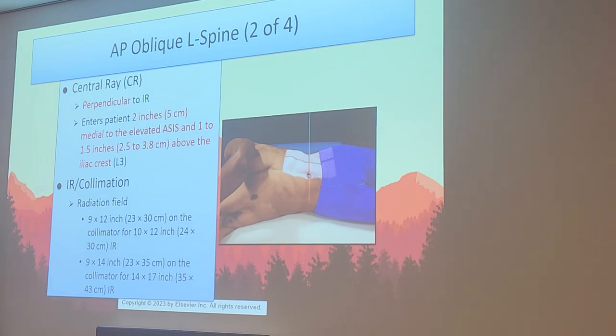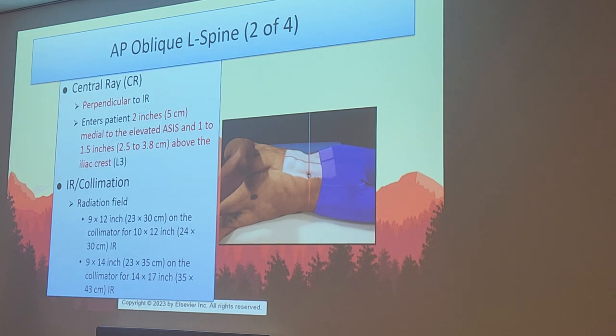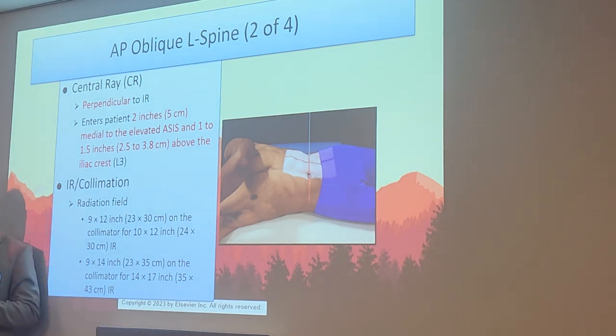All right, we are still using a perpendicular central ray. Now, the centering, please make note of this centering. It tends to throw a lot of people off. We are going to be 2 inches medial to the elevated ASIS. In other words, we are centering towards the elevated side or the upside. And we're going to be 1 to 1.5 inches above the iliac crest at the level of L3. Slightly above the crest towards the elevated side.